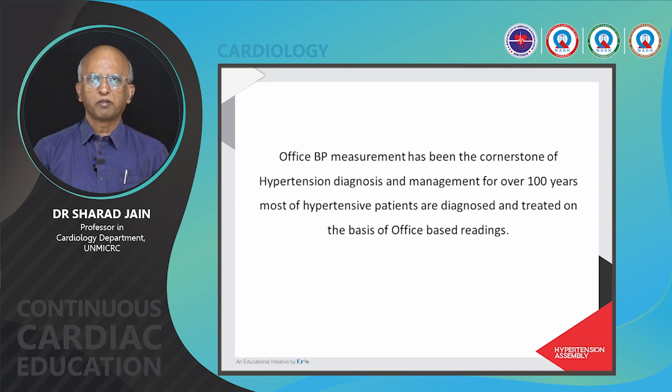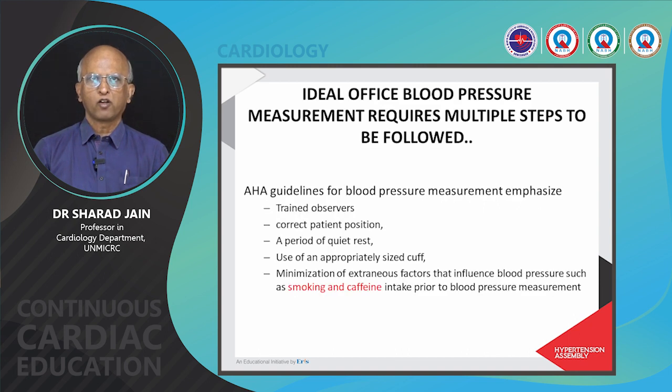Office blood pressure measurement has been the cornerstone of hypertension treatment, and still is the cornerstone, because most of the time it is the only way in which the patient is treated. It has been available for the last 100 years. Most hypertension patients are diagnosed and treated on the basis of office-based readings. The ideal office blood pressure measurement requires multiple steps, which are many times lacking in today's busy clinical practice.